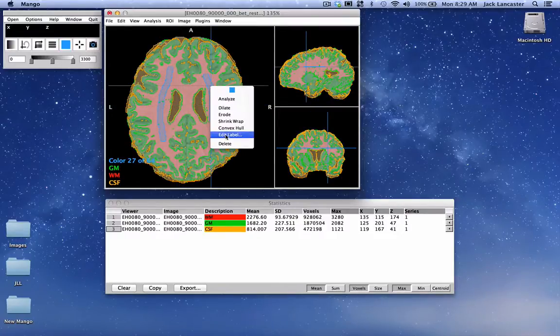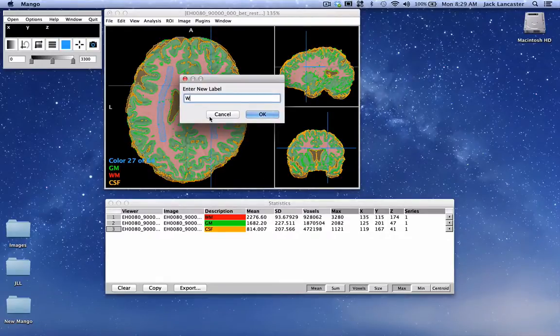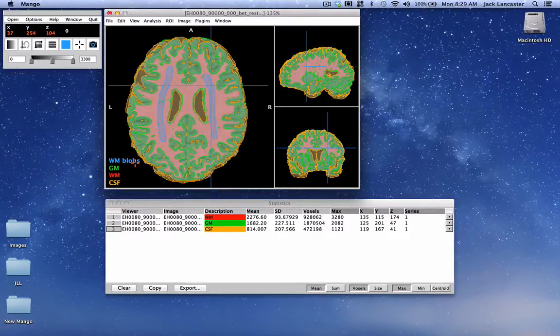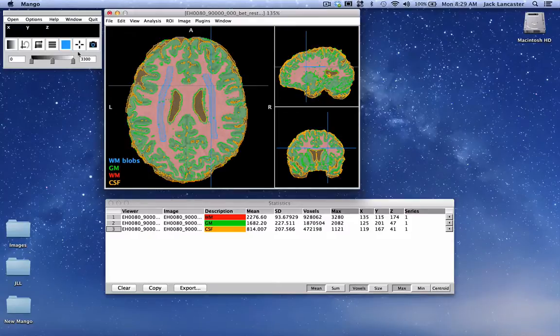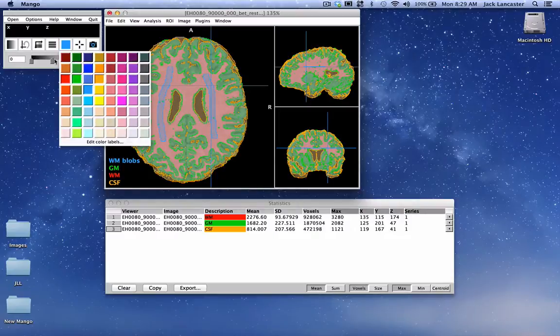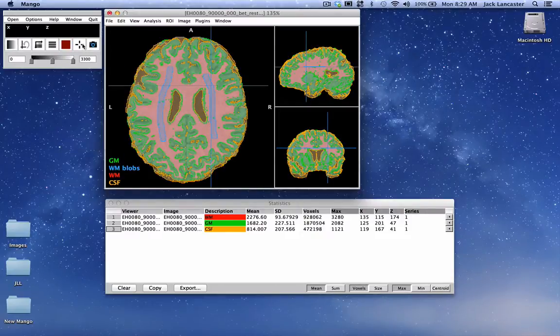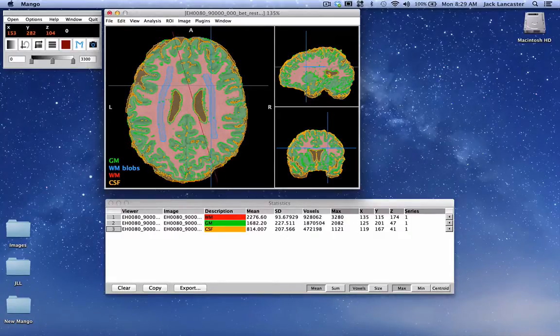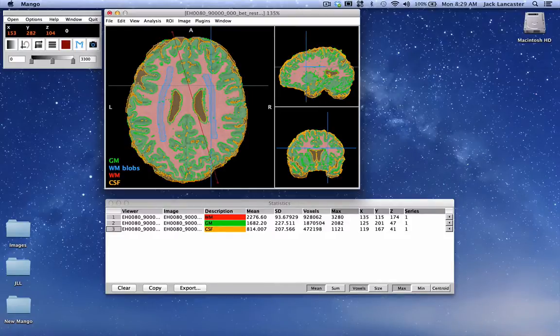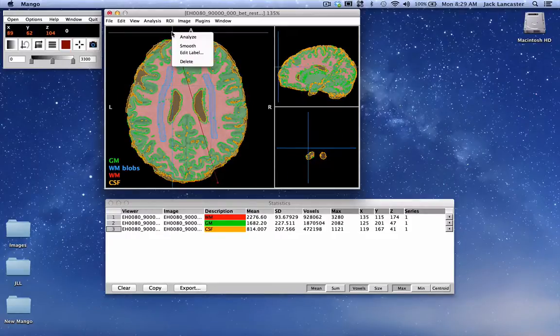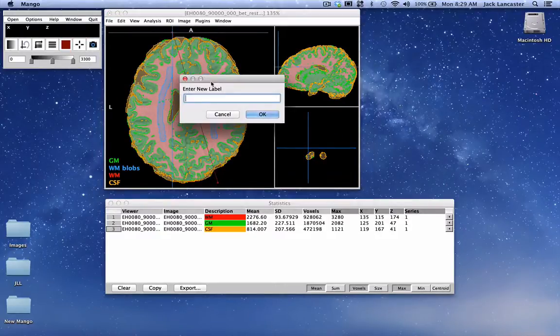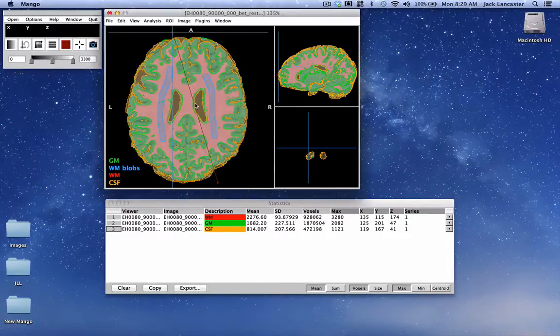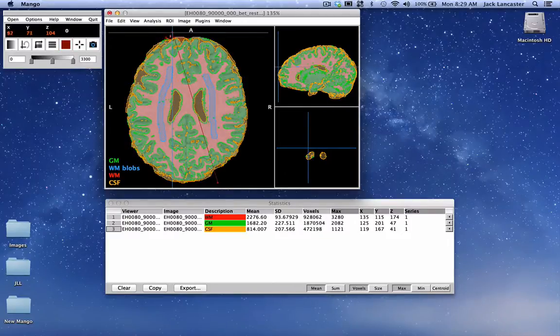Let's pick one as blue and come down here to paint mode so we can paint something in here kind of like that. The quick toggle out of this paint mode is the F key. Notice this region label is now color 27 of 64 because we're in 64 color mode, but I can give it a better label. Since it's in white matter we'll call it white matter non-specific plaque. The label now makes it at least subsets in terms of what we have there. Let's pick another color, maybe a little brownish, and we're going to trace a line. We can trace a line from up here down here, hit return to close the line, F to take us back to pointer mode. We can put a label on this line and we'll just call this the AP line.